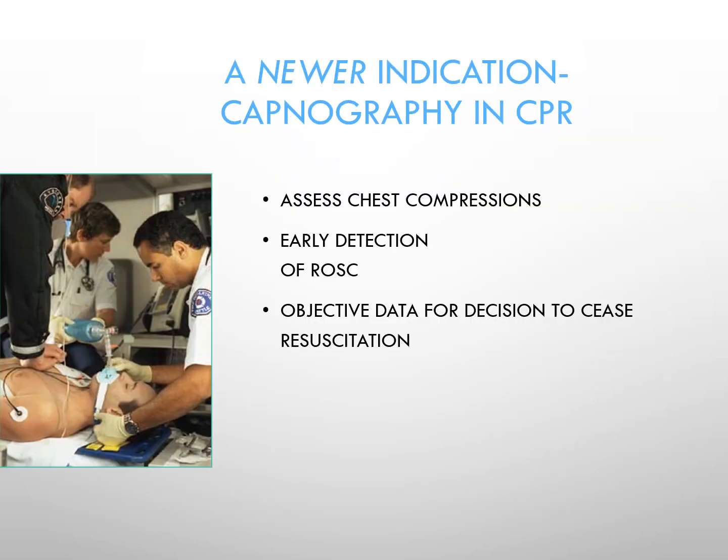One of the newer indications is to look at capnography during CPR to assess chest compression quality, and also to detect the return of spontaneous cardiac activity. In the next slide, I'll show you a depiction of what that would look like. In some cases, capnography can also serve as objective data for the decision to cease a resuscitative effort.